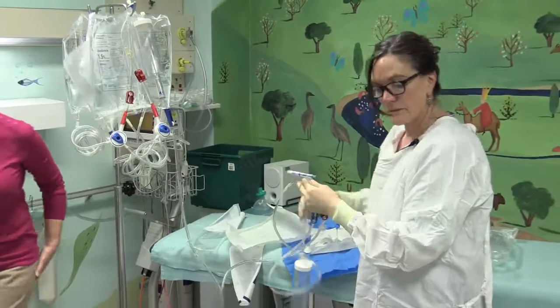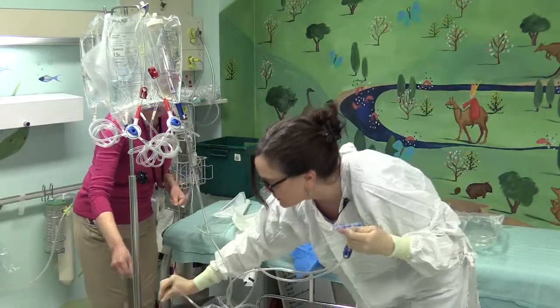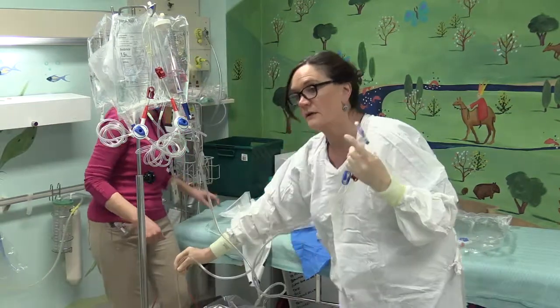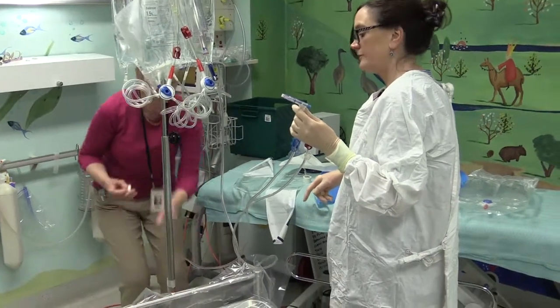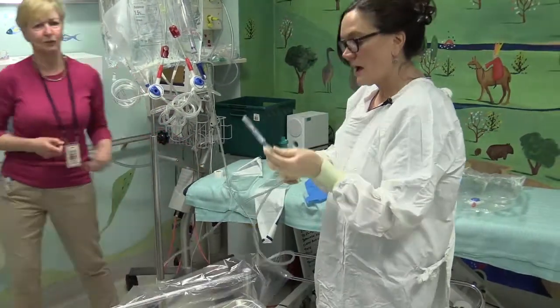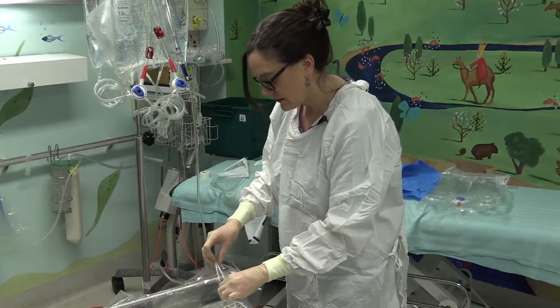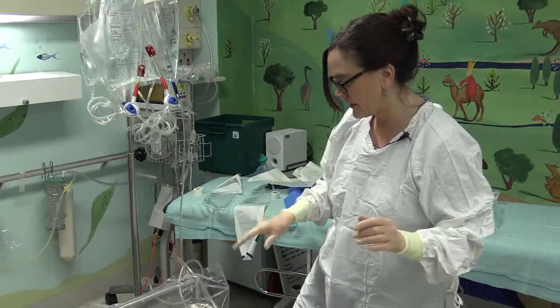And my assistant will tape the drain cylinder onto the pole at a low level. And I need to secure that end so that it doesn't fall off. So keeping an eye on that.